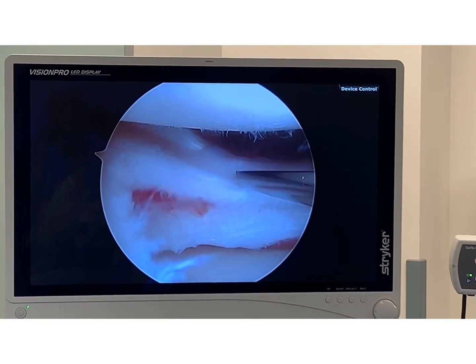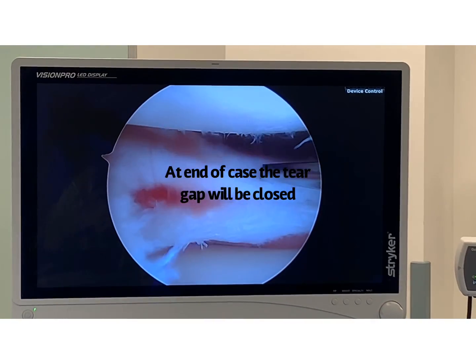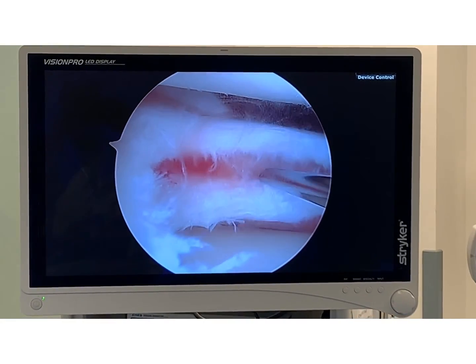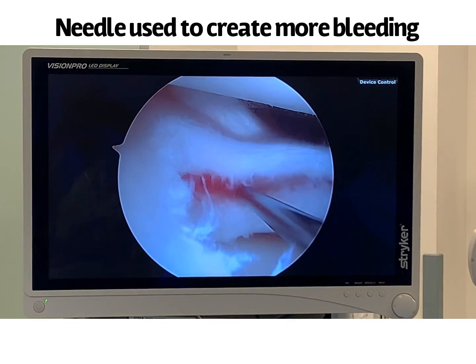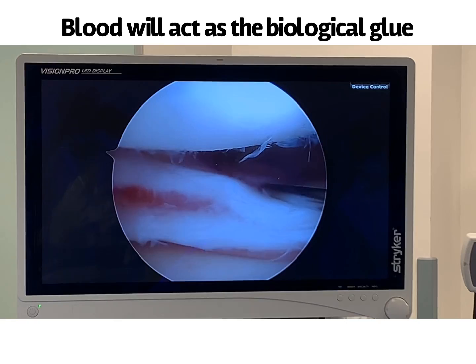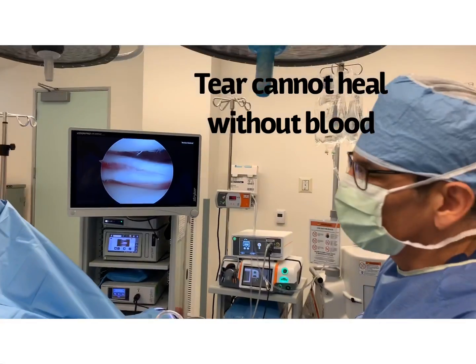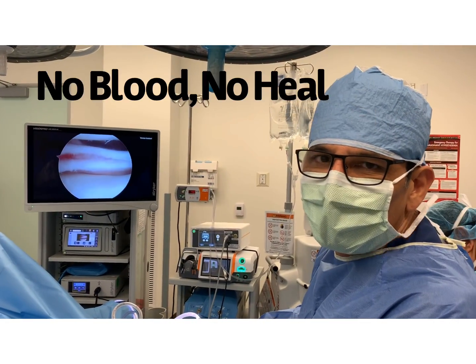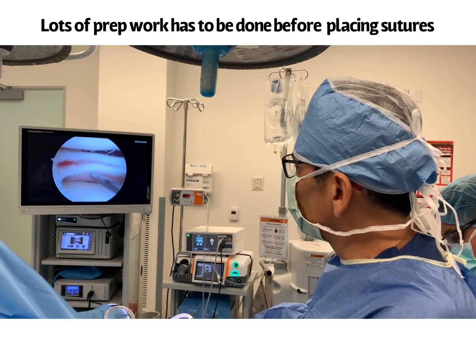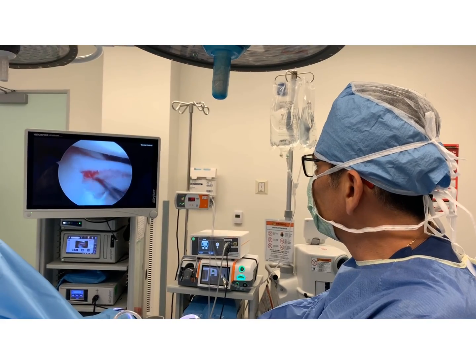What I'm going to do is bring this upper flap together with the lower flap and tie it down and squeeze it down tight. Before I squeeze it, I'm creating some little blood channels or vascular channels with the spinal needle — trying to bring some blood into the area because it's going to need blood in order to heal. Injuries don't heal without blood. If there's no blood, you might as well tie two pieces of beef jerky together — it won't be healing.